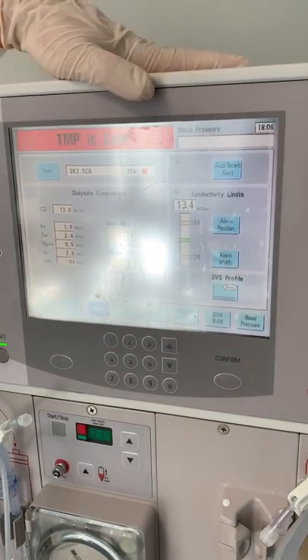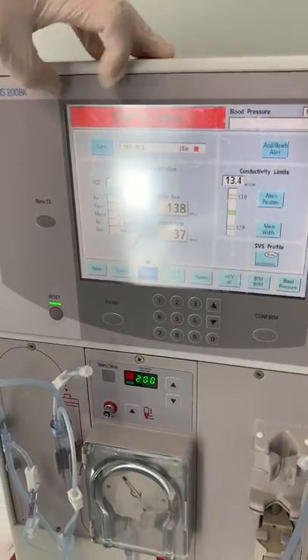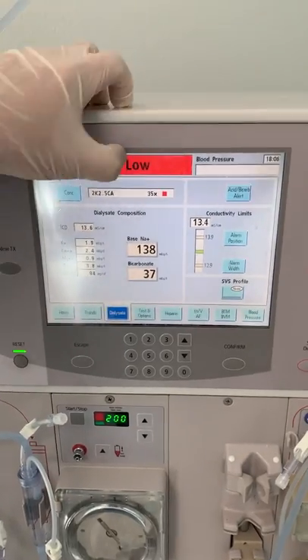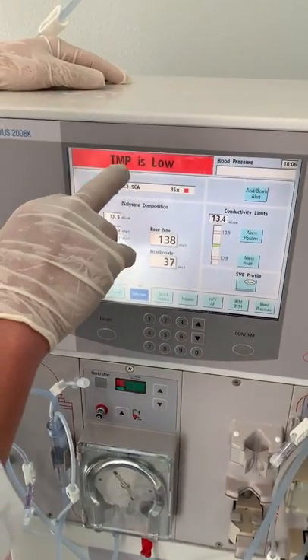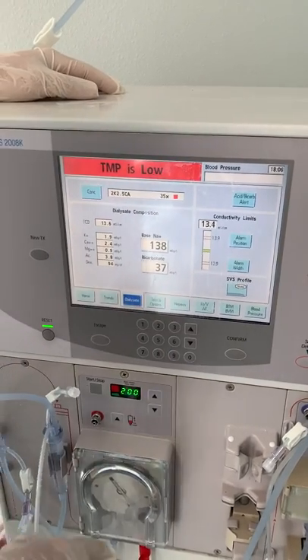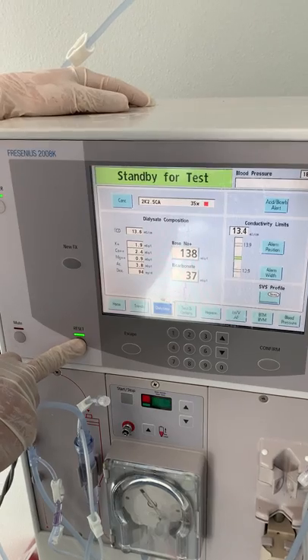In order to put this on test, we want to make sure we are on a green setup. Right now we are on red TMP low — every time you see red, that means your machine has stopped. This alarm is transmembrane pressure. Just press and hold Reset and it will move to the next step.